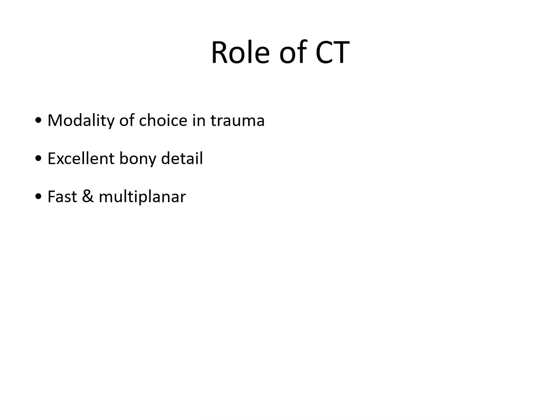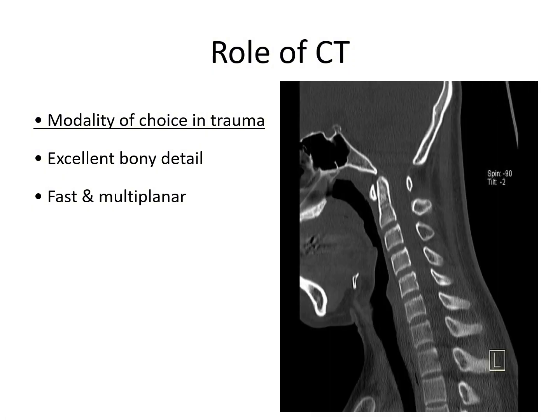Now the CT scan. So what is the role of CT in the spine injury imaging? It is the modality of choice and it is excellent for bony details. For bone visualization, CT is excellent and it is the modality of choice for trauma, and it is very fast and multiplanar imaging can be done.